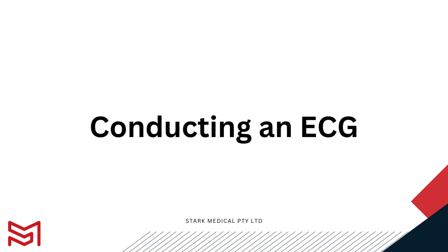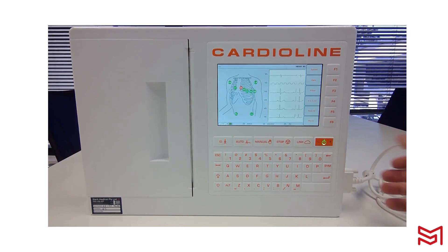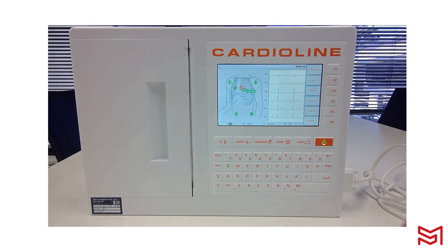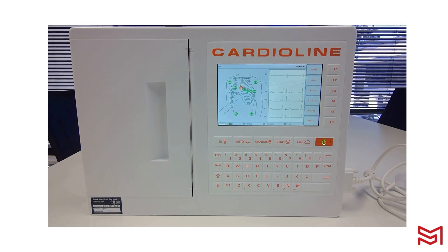Now that your CardioLine unit is set up, let's work on conducting an ECG. Turn the device on with the orange power button and once the device has loaded, it will bring you to the home screen. As you connect your patient to the cable set, you will start to see your leads change from red to green. When all leads are green, the screen will change to be completely visible and you can see the full trace quality across the screen.